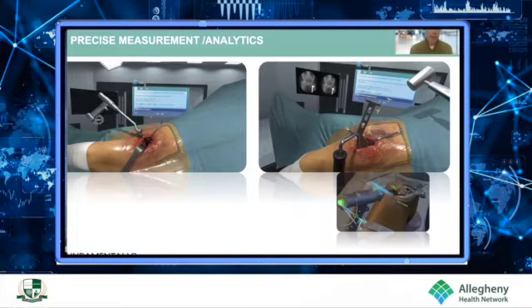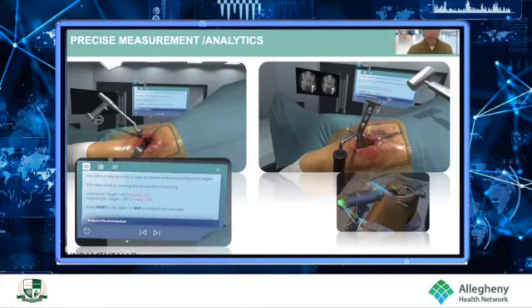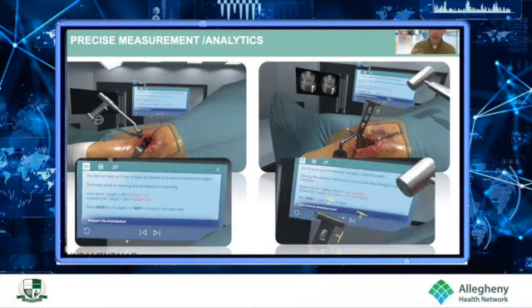Overlays that will give you instruction and give you real-time feedback. So you can see some overlays on the right-hand side of the screen here. You can see some real-time feedback on the left-hand side in terms of the angles of approach, etc., all fed back immediately to the user of the system, of the virtual reality.